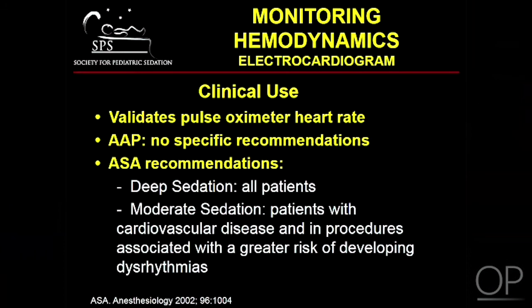A final consideration is continuous electrocardiogram monitoring. This monitoring modality gives an additional source of heart rate data that can be used to validate the rate given by the pulse oximeter. Given the reality of frequent pulse oximeter artifact, this can be an invaluable source of information. Although the American Academy of Pediatrics has no specific recommendations for electrocardiogram monitoring, the American Society of Anesthesiology recommends its use in all deep sedation cases, and in those patients undergoing moderate sedation with either a specific cardiac disease history or that are having a procedure associated with a greater risk of developing dysrhythmias.